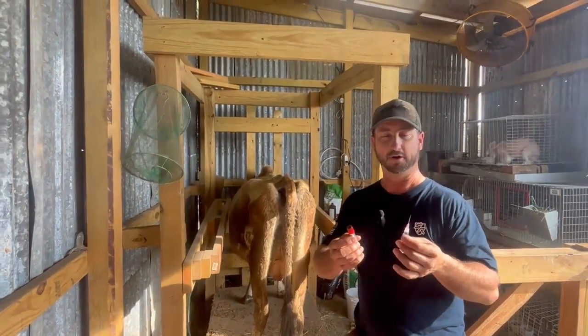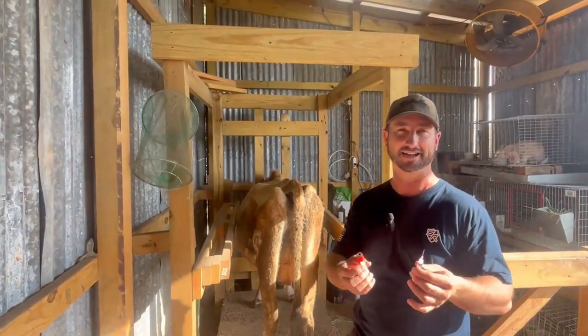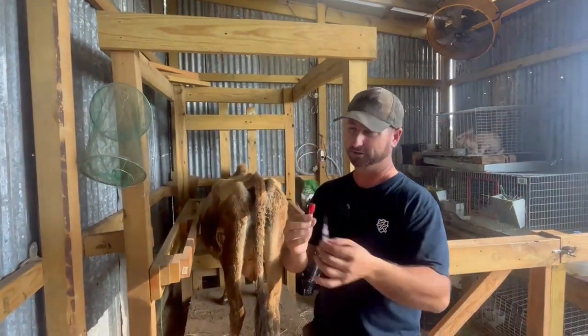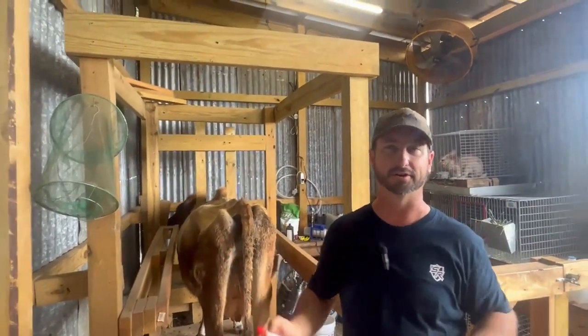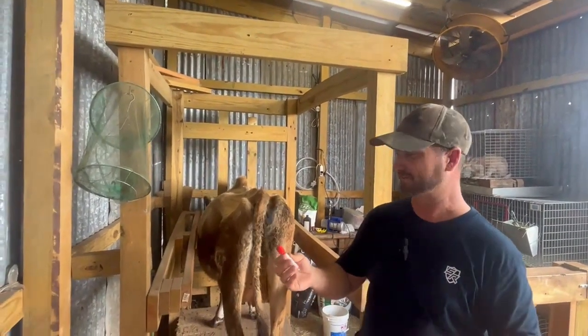I use a company called BioPregCheck — that's B-I-O-P-R-E-G-C-H-E-C-K — and it's easy to buy these materials. All you need is a syringe and a little test tube. You draw two cc's of blood from the tail, put it in the tube, mail it off, and within a week they'll email you results. Then we'll know if we have to do this again or not.